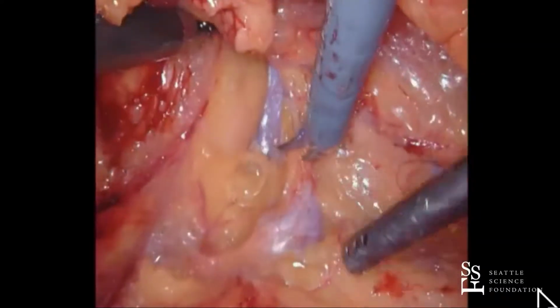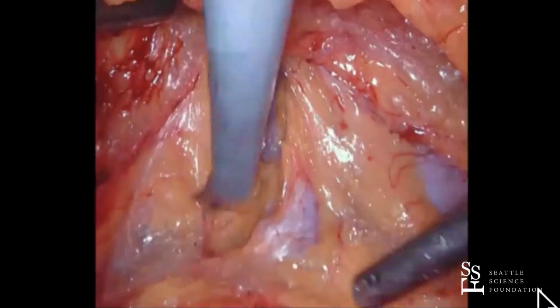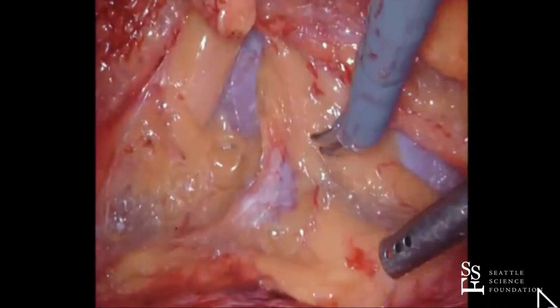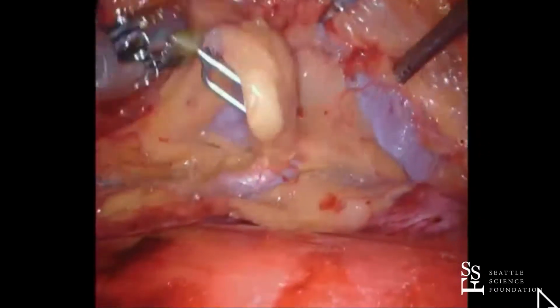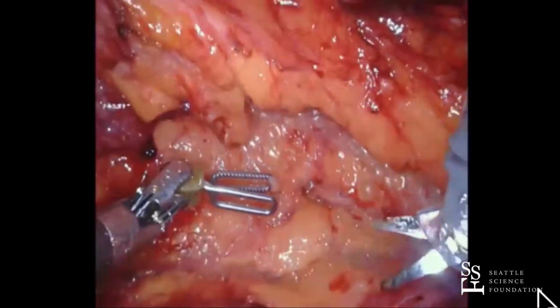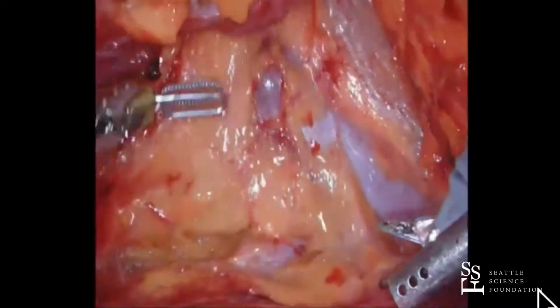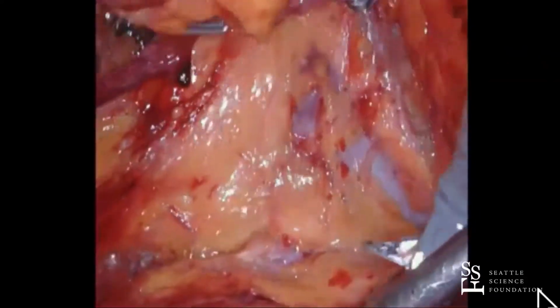And just a comment about the ureter. If you ever have to do a pyeloplasty on somebody who has a hostile abdomen, this is actually a nice way to do a pyeloplasty. I've done that a couple times just to avoid going into the peritoneal cavity, and it's very doable. There's tumor right there, it appears.